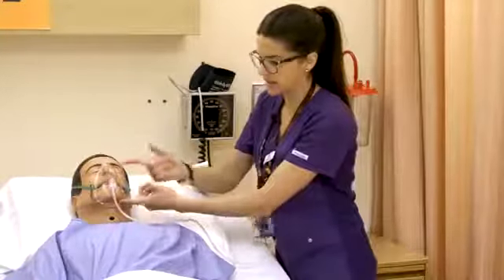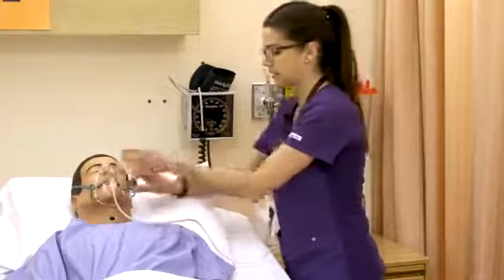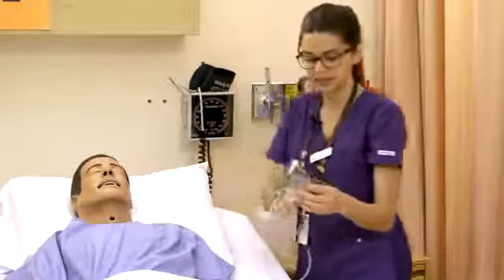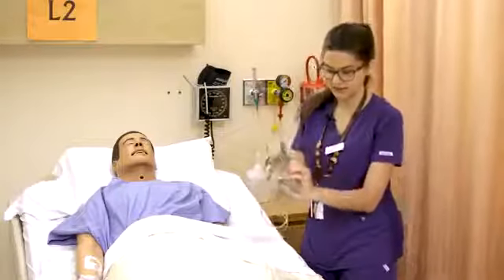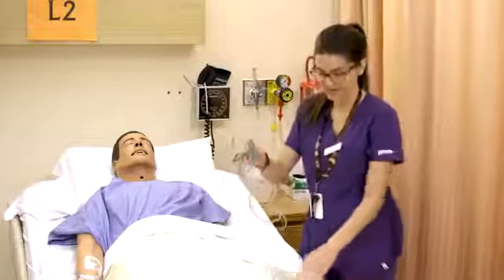This is obviously an adult size mask. It fits nicely on Jake. And you want to make sure that it's delivering oxygen. And again, you're monitoring the person's respiratory status. To move seamlessly onto the next mask, we will move on to the rebreathe mask.